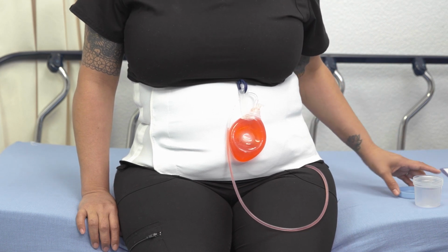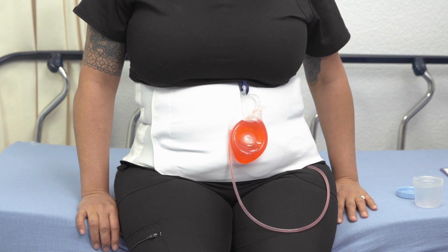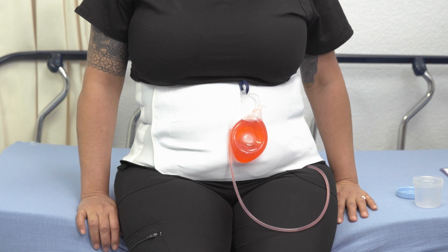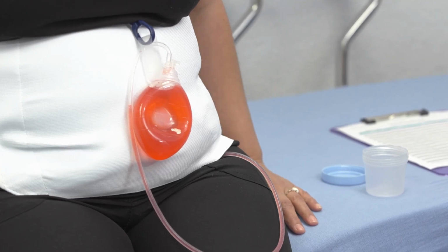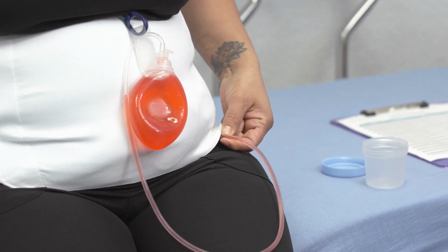You'll notice on the measuring cup there are markings for the measurements. There is an ounces side and a milliliter side. You're going to want to document your measurements in milliliters, not ounces. So to start, you're going to visualize the lowest point of the drain tube that you can see, either coming out from your garment or a dressing.